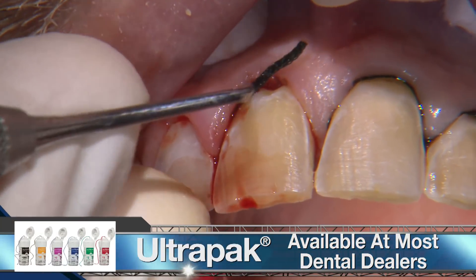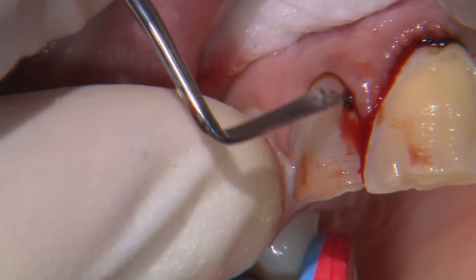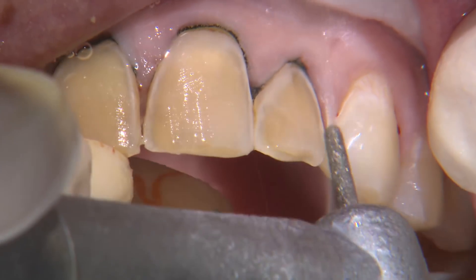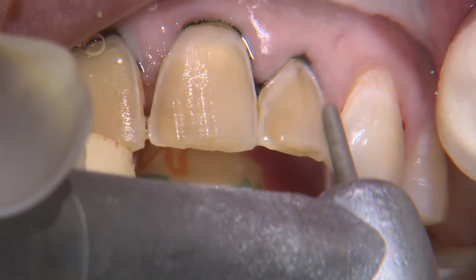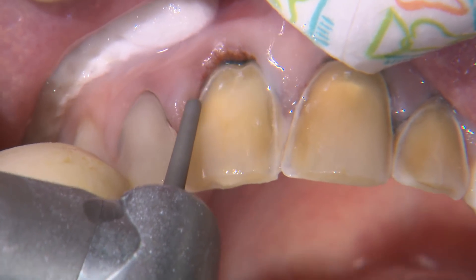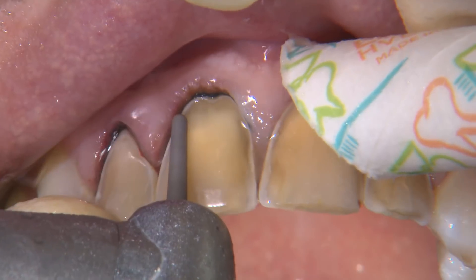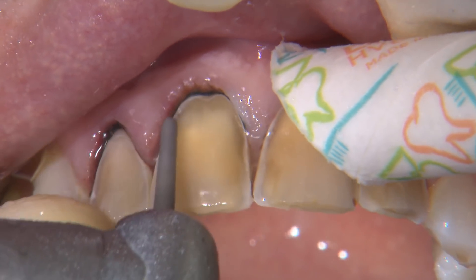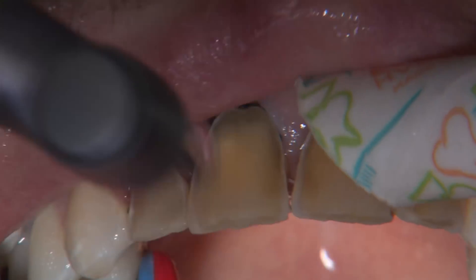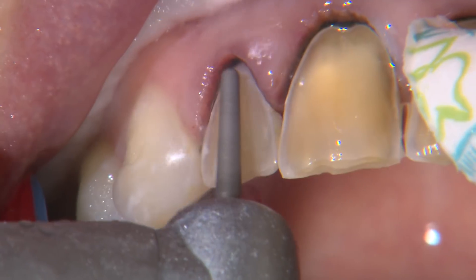Once the old restorations are removed, I place a triple-zero cord down in the sulcus to help push the gingival margins out of the way. The gingiva usually moves apically at least about half a millimeter. This is really important for any anterior crown or veneer — not only to avoid inadvertently damaging the soft tissue, but to also hide the restorative margins slightly subgingival once the gingiva rebounds. I position and refine the gingival margins only after the placement of the cord. Using the same round-ended tapered diamond, I reduce the prep so the margins run along the soft tissue equigingivally. The tip of this bur is approximately 1.2 millimeters in diameter, so I run it along the margins until nearly half of the bur is placed into the tooth, creating a clear chamfer and allowing for uniform thickness of the final restorations.